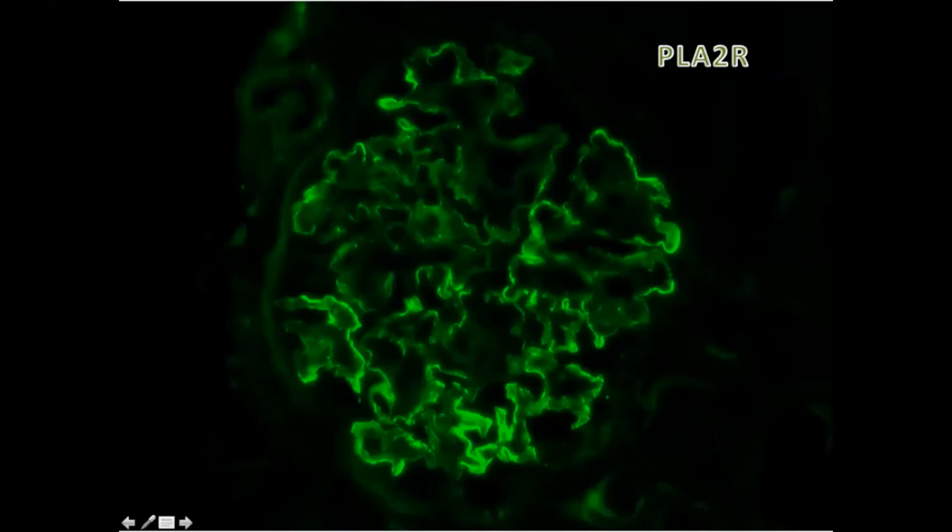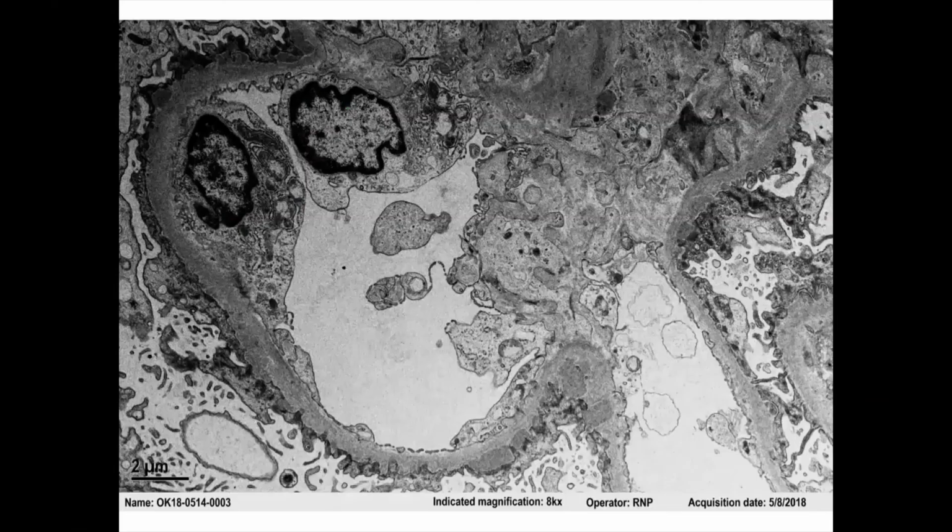Yeah, primary, exactly. Well done. This supports for us that this is most likely a primary membranous glomerulonephritis. And then this is electron microscopy, and we see that we do not have mesangial deposits.